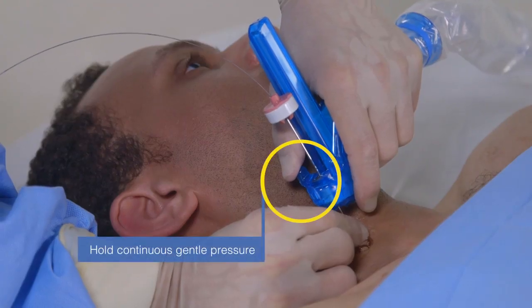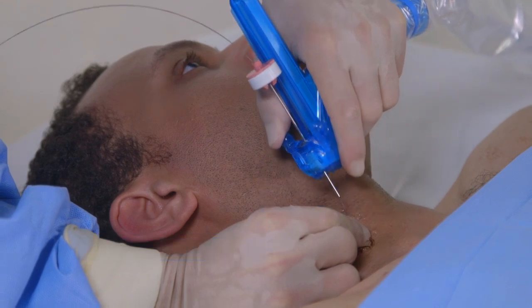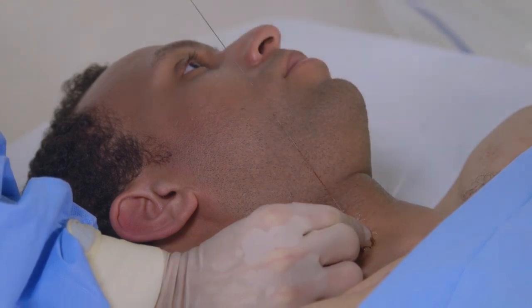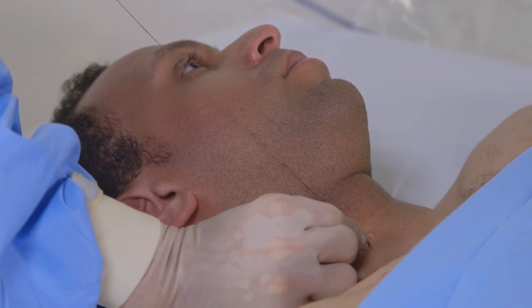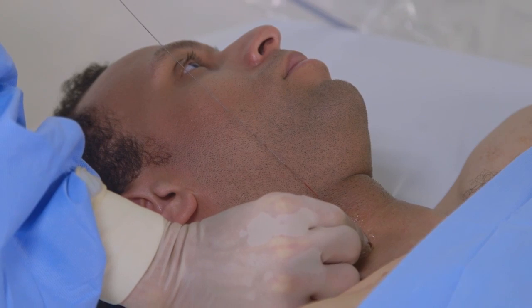While holding continuous gentle pressure on the needle clamp, withdraw the probe and needle over the guide wire, gripping the guide wire between the thumb and first or second finger once the needle tip clears the skin surface. Continue with the Seldinger technique. There will be times that the central venous pressure will be so low that the internal jugular vein will simply remain flat after the pressure of the probe is let off. In that situation, I recommend moving to the supraclavicular approach that I describe in another video.